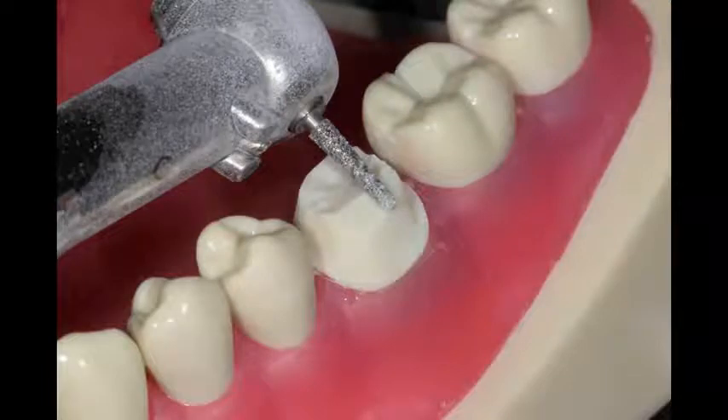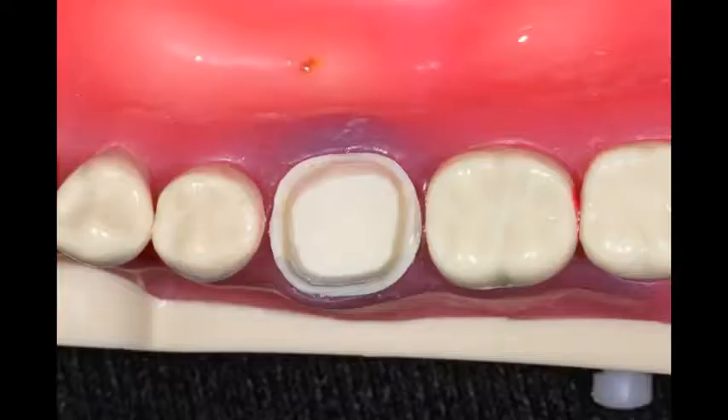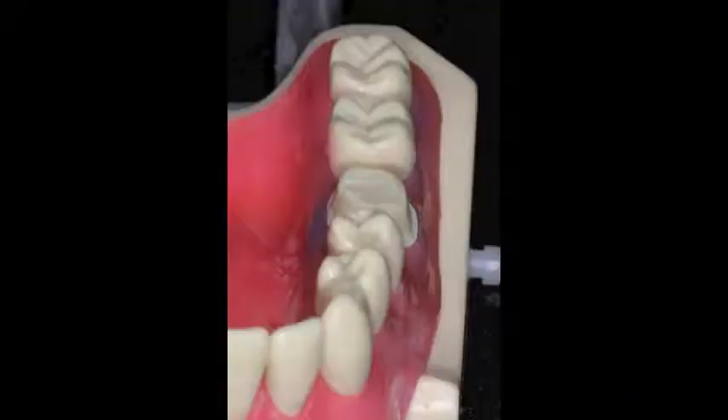Then I finish it up by just placing the final touches on the gingival margin. The kind of crown I'm using these days — and this was filmed in 2012 — is an Emax crown. The nice thing about that kind of crown is you're able to put the margin right at the gum line. You don't really have to tuck it underneath the gums like you had to with a PFM, or in some cases you can leave it supragingival.